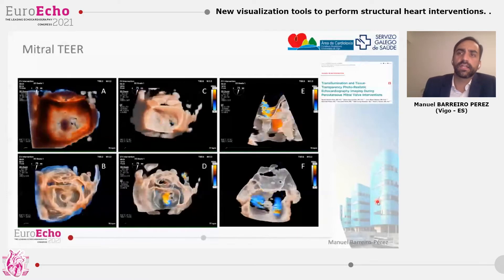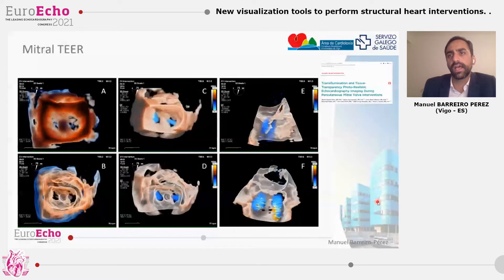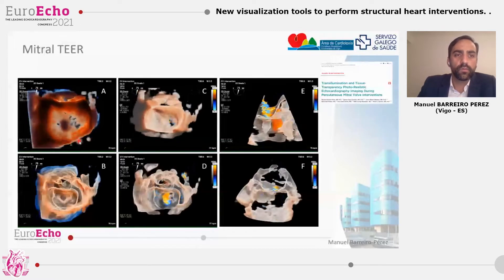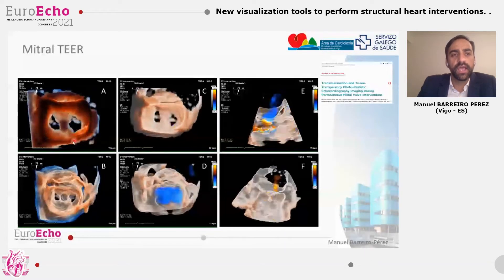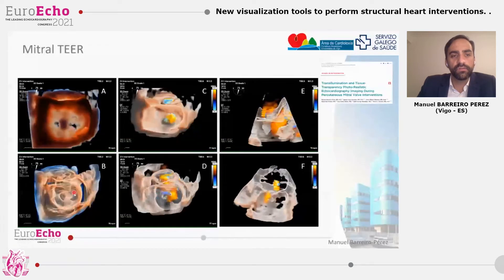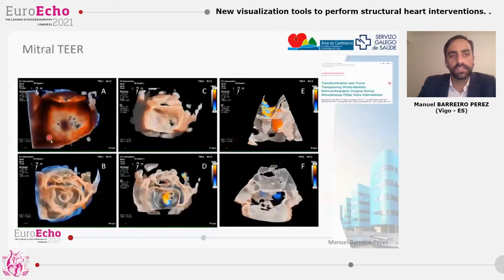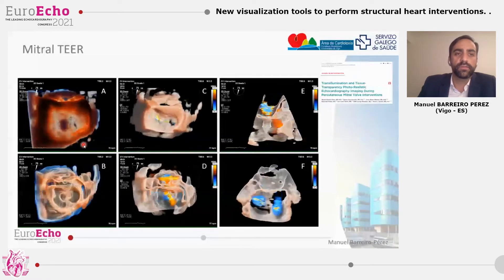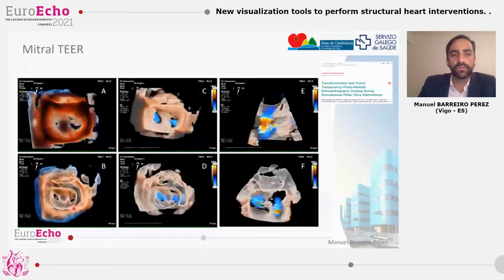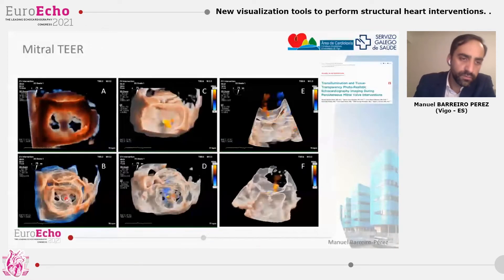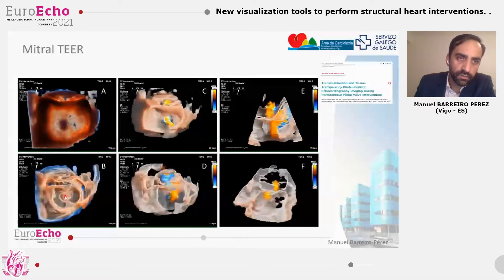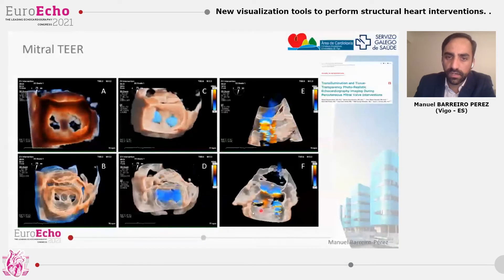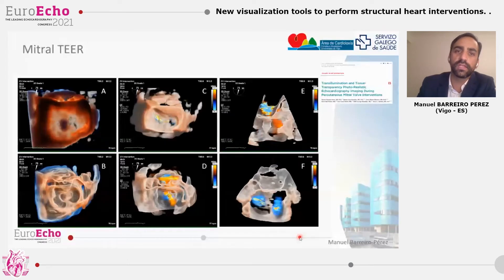In the mitral transcatheter edge-to-edge repair, this new tool has many capabilities — for example, to study the quality of the leaflets, the quantity of leaflets included in the grasping, and the tension and anatomy of the new orifice areas. Transillumination with the true view is more useful for studying the quality and grasping properties, while the glass view is better for studying the anatomy of the new orifice. The glass view, by erasing the artifact of the clip, is also really useful for locating residual jets — for example, in that case immediately lateral to the clip.